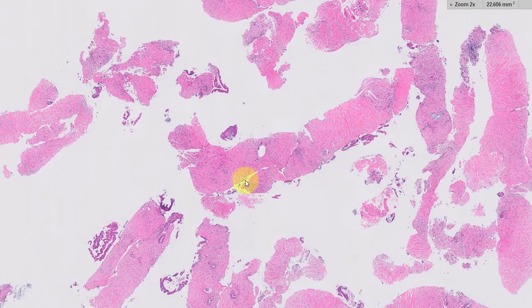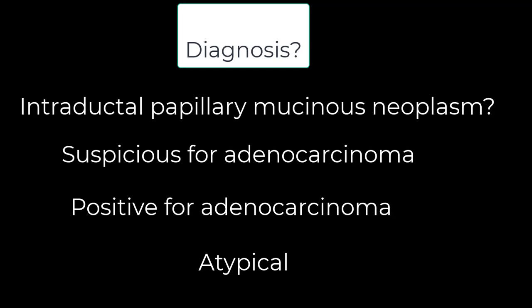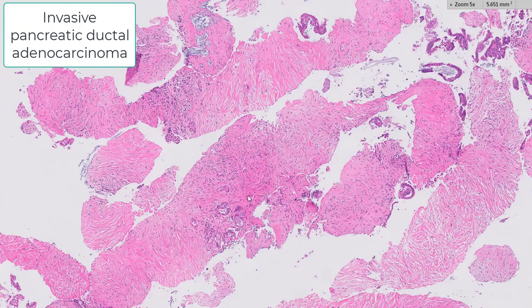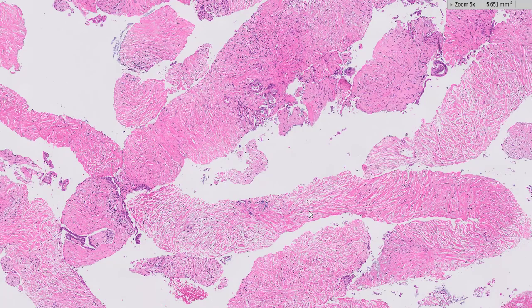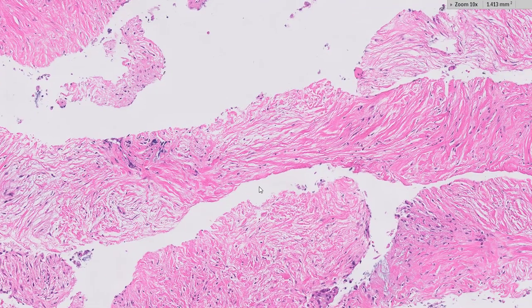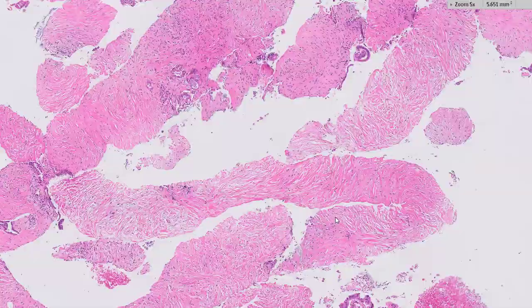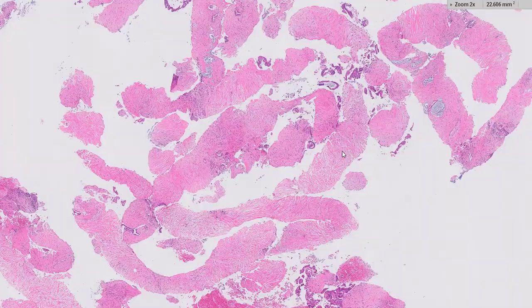So the question is: what is your diagnosis? This, of course, turns out to be an invasive pancreatic ductal adenocarcinoma. I just wanted to hit upon some highlights of these EUS-guided biopsies — they're great, there's a lot of material.